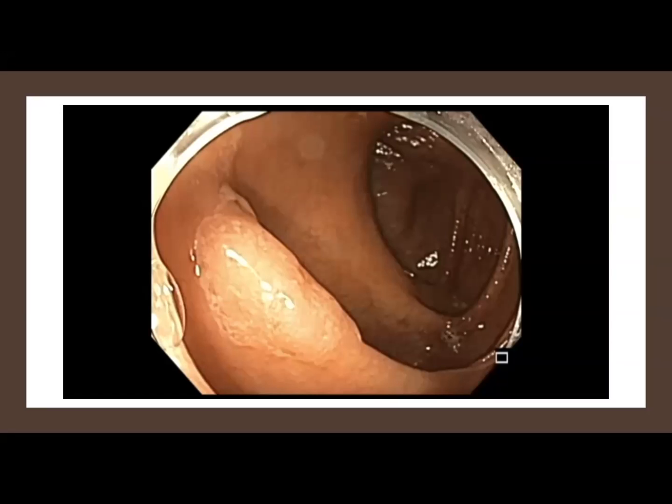One is if you are not sure about the margin and you don't define it well, you will leave tissue behind. The second is that when you leave tissue behind, the next time you come in to resect, it will be very hard because it's not going to lift well.